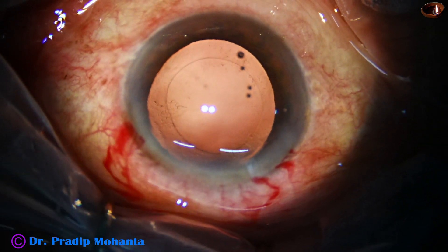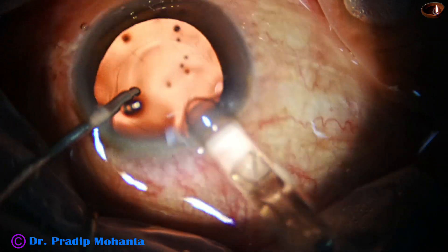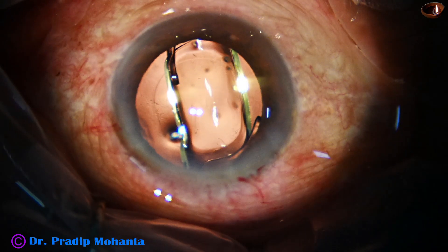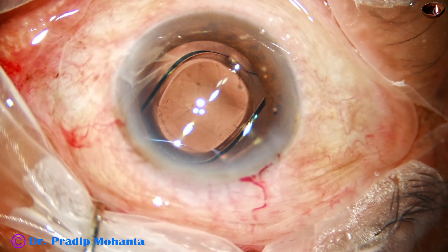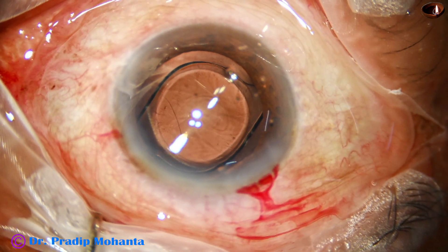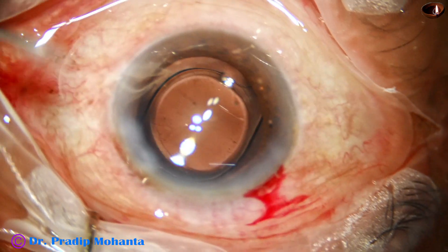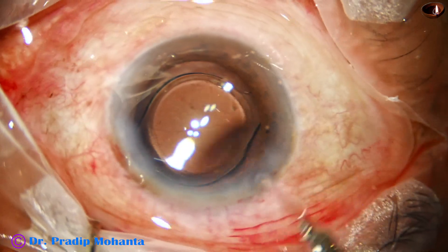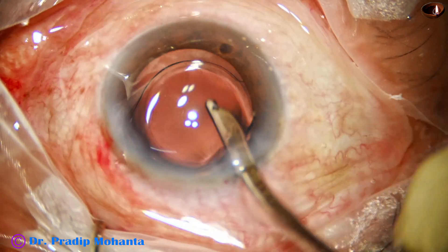This is a hydrophobic acrylic single-piece monofocal intraocular lens. See the rhexis — it is overlapping the lens all around. The rhexis is not small; the size of the rhexis is about 5.5 millimeters and it is overlapping the intraocular lens all around. This is an ideal rhexis. If we train ourselves to achieve this, we can manage most cases without femto-laser.